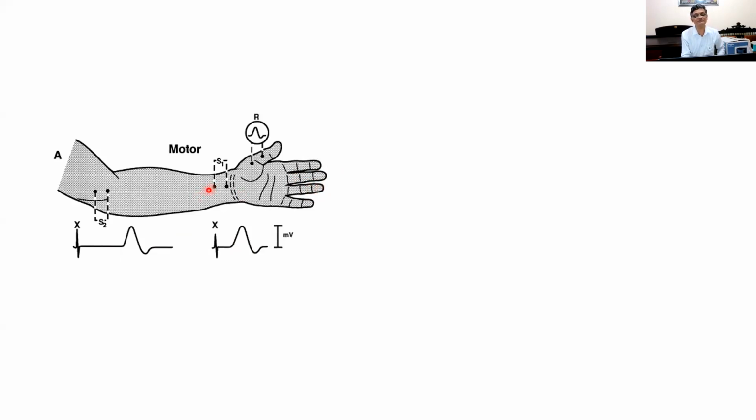On the nerve, you keep the recording electrodes, and you stimulate the skin over the finger. And you can do sensory studies. That is also sometimes needed, but to understand the principle we will concentrate only on the motor studies, right? So it's stimulating a motor nerve, the median nerve, and we study the motor aspect, not the sensory aspect, right?